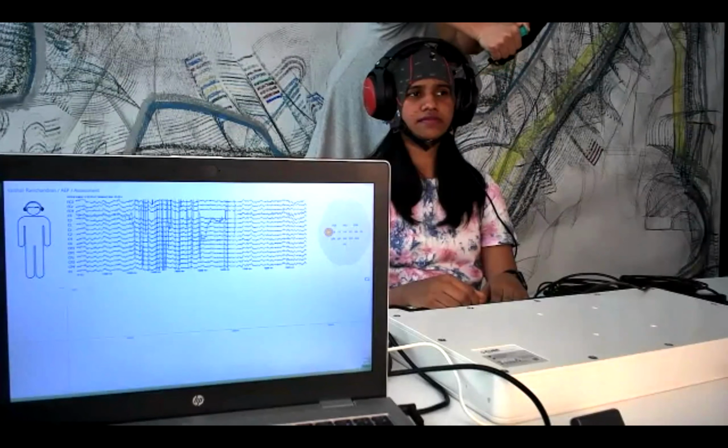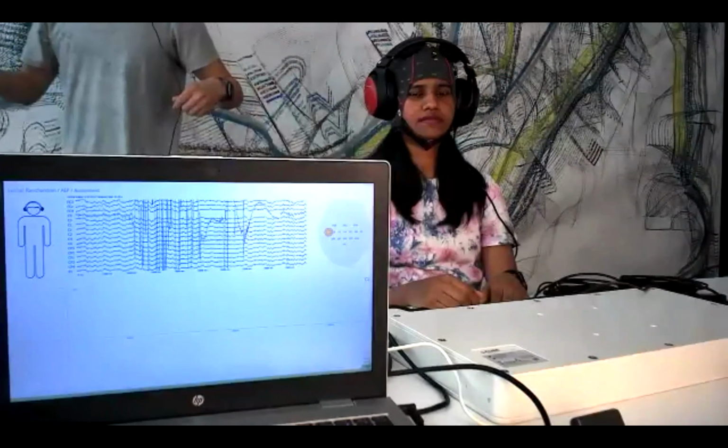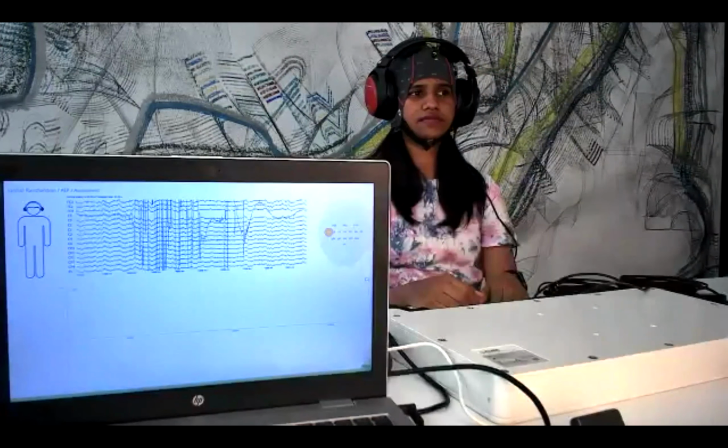I think around now it's acceptable. Just make sure. I think it's really perfect.